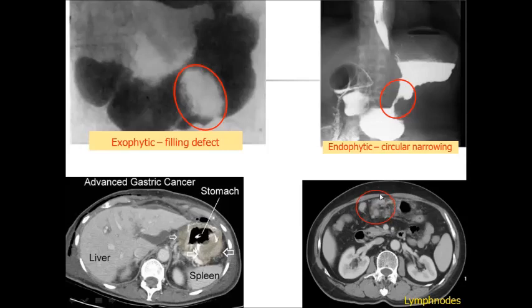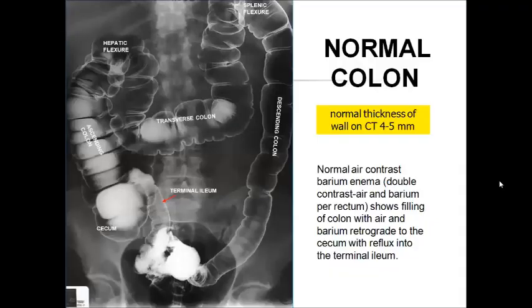Regional and distant lymph nodes are very important in decision about treatment. Status of lymph nodes is very important in making decision about treatment of gastric cancer, and on plain X-ray film lymph nodes are completely invisible. On CT, you may observe them very clear.